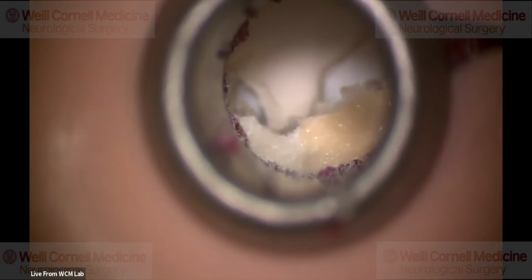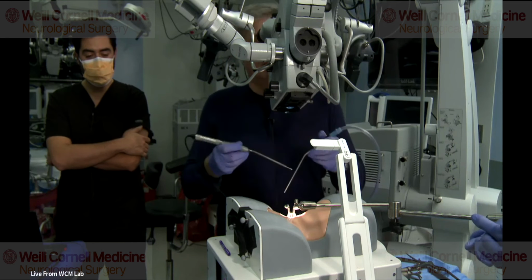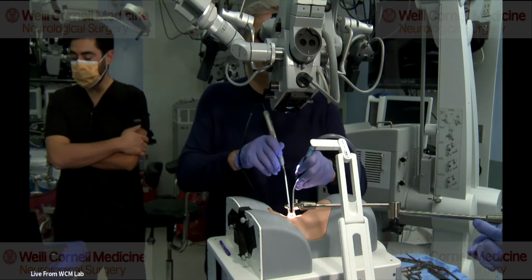The curette is fine too, but the curette is bigger, right? With the ball tip, it really allows you to feel for the pedicle, for the smooth pedicle. With a curette, it's too short and it's too big. You may not be able to get there. I use the curette too, but not for this. To feel for the pedicle, the ball tip is, I think, much better.